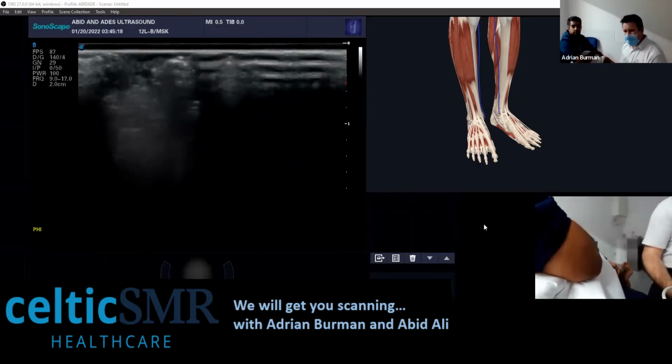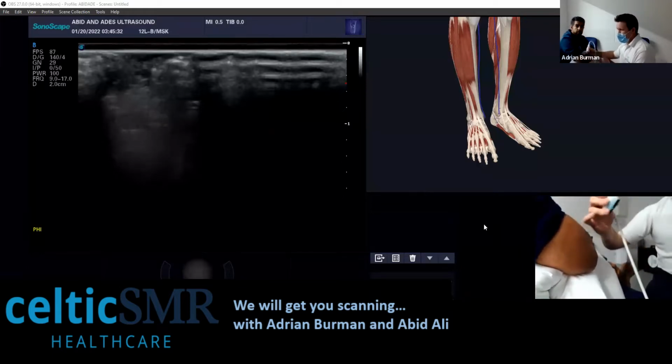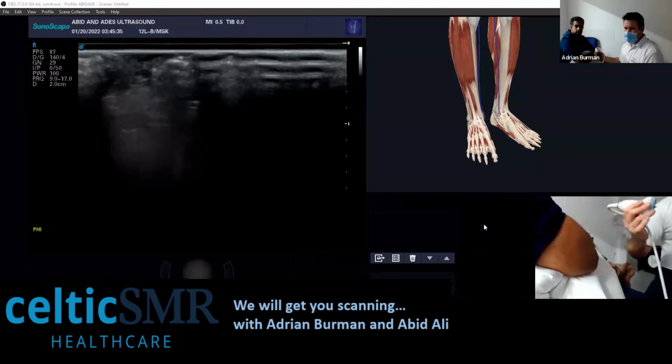That gives you the best option to get the best technique out of your scan, whether you need to add less pressure or be in a position where you're not going to cause yourself any musculoskeletal problems, because if you're doing this all day, they soon add up.